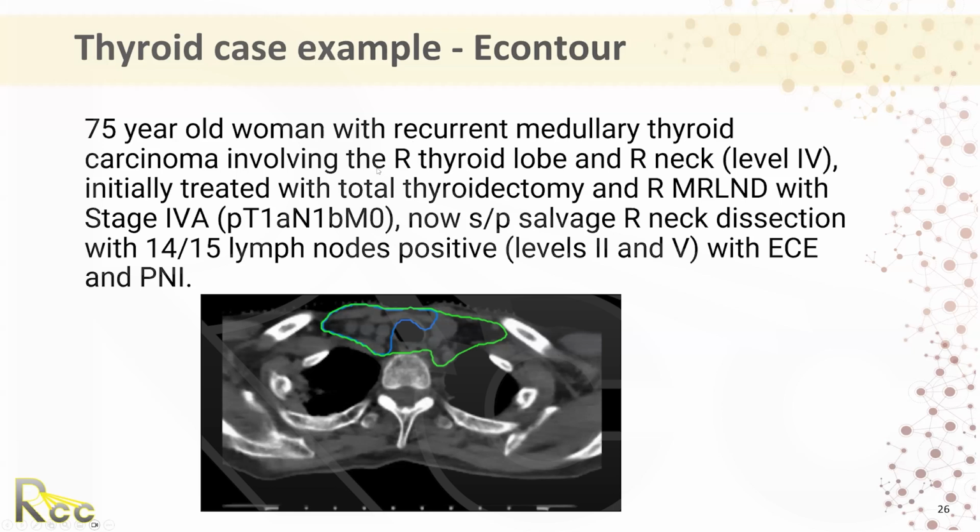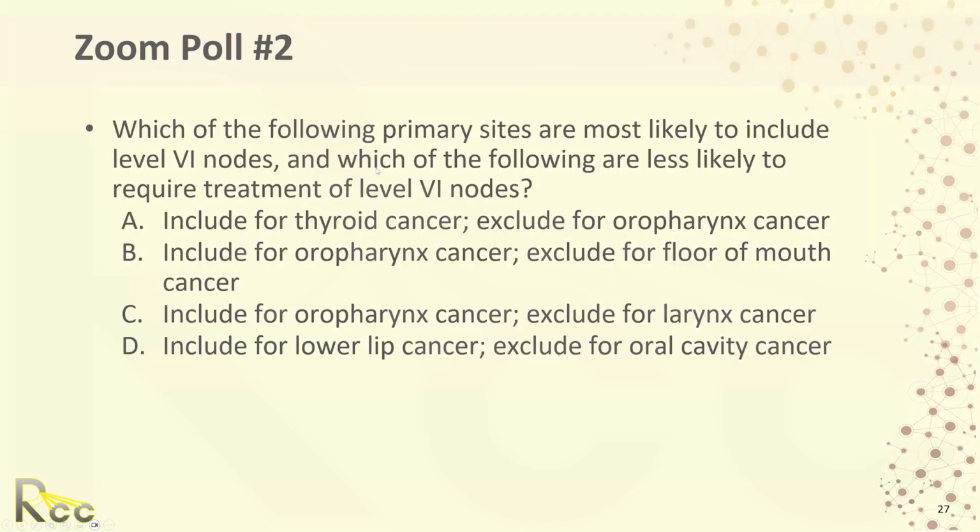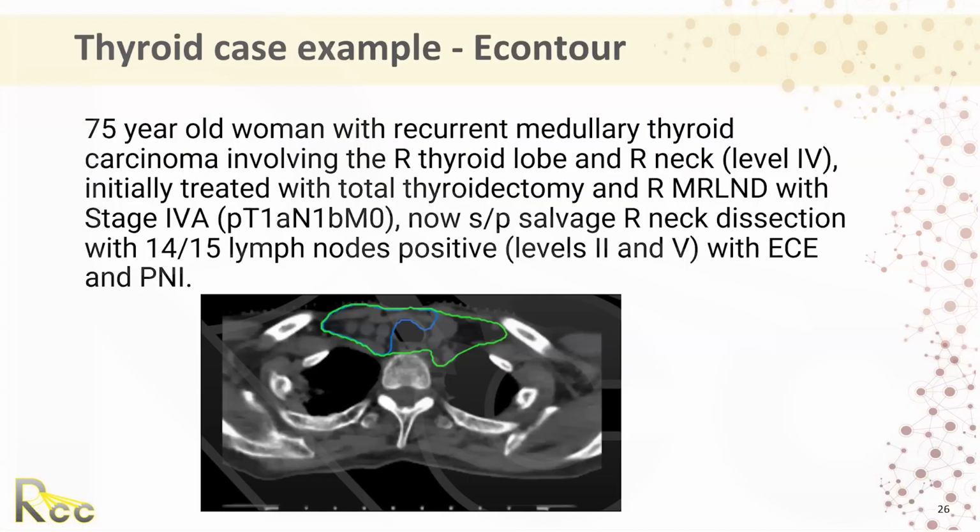Chris, we have one last question from before this. Someone is asking in which cases you will go for the 6th level inferior to the manubrium. Is there any case where you go inferior? Definitely. Sorry, I probably should have put a formal slide in this. It's a great question.